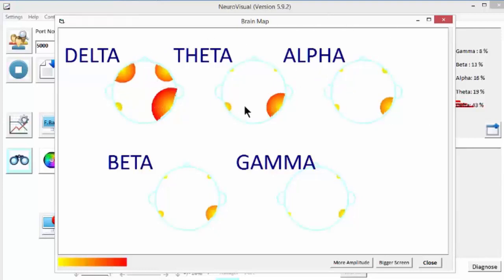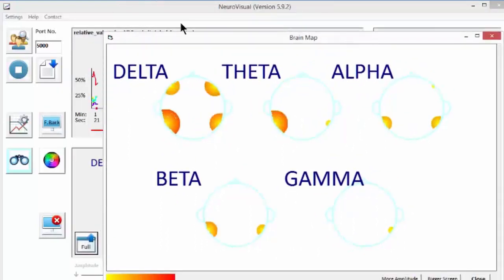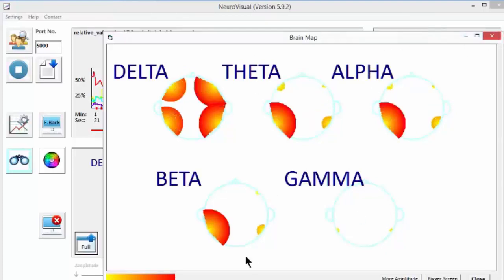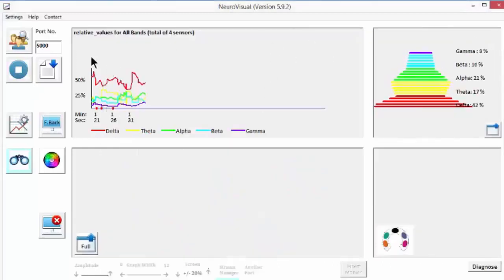We're looking at frontal and medial temporal, and so it's showing you where those are relative to what we are observing on the phone screen as well. So, in fact, you could almost just put the phone screen aside, and then we can just look at the map itself.